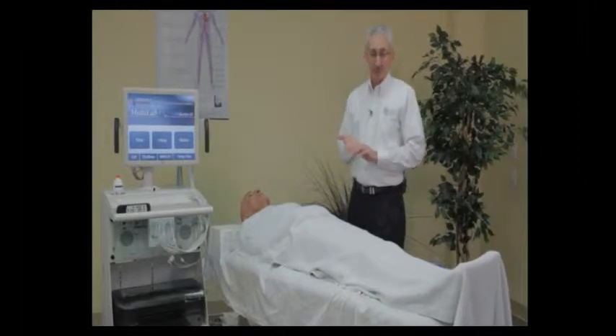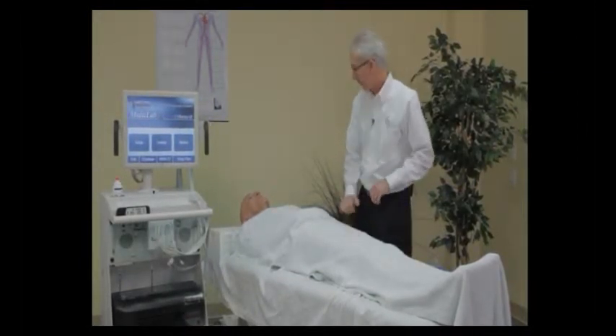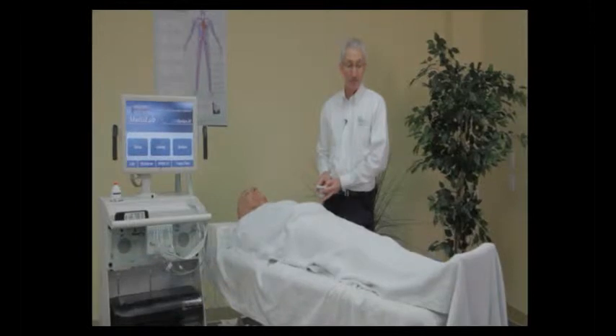The other thing that's important is the bed height. This is not exactly a good height for me right here, so I'm going to raise the bed up a little bit. Ergonomics is extremely important if you want to continue to perform exams for many years.